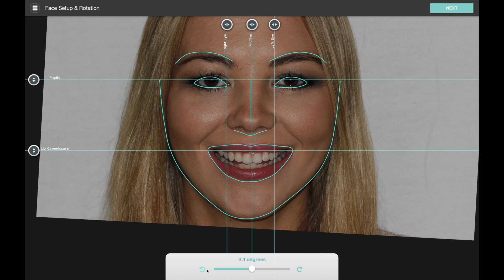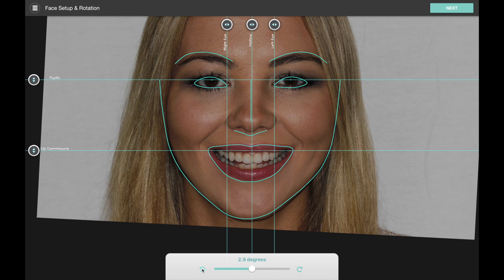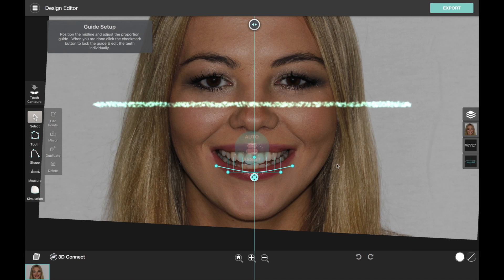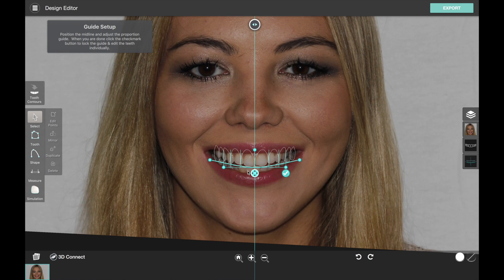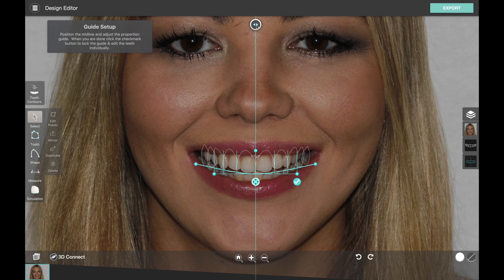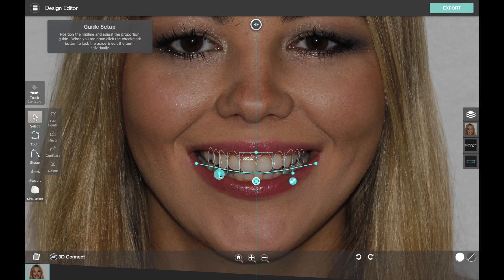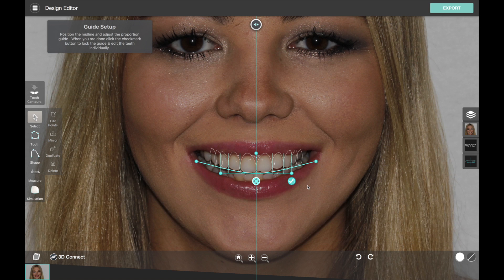If we want to tweak the proposed rotation of the face we have buttons on the bottom and we can straighten the photo manually or using the slider. Once we're happy with that we click the next button and now we're in the editor. You see this Auto Assist animation where the software is actually coming up with an initial proposal for where the teeth could go. We have our proportion guide which has some teeth already attached to it, and we can adjust the midline as well — basically we start adjusting the teeth by adjusting this golden proportion guide, which moves the teeth along with it to create that initial proposal. This gets you very close in just a few seconds.